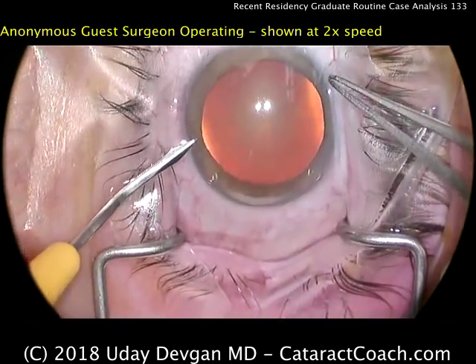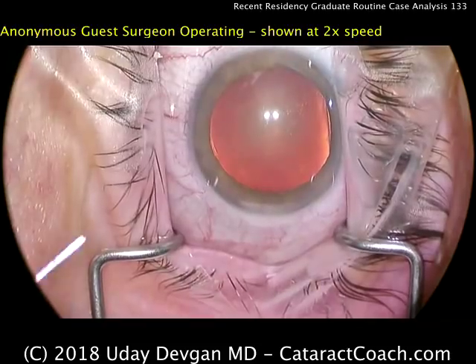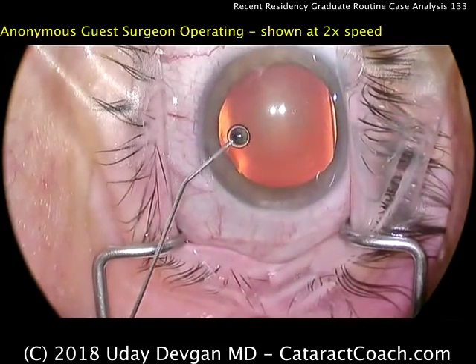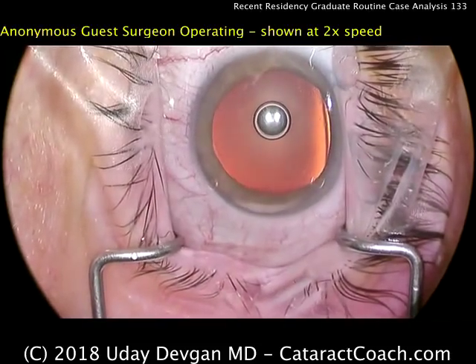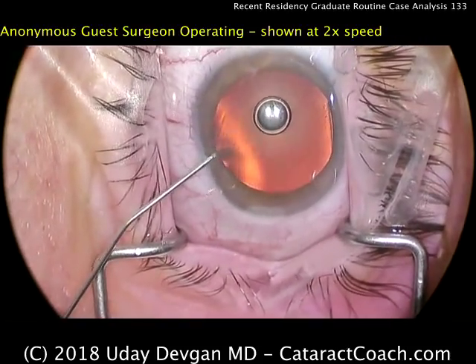CataractCoach.com. Today we're watching a routine case as performed by a recent graduate of an American residency program. This is not one of my residents — this was an anonymous submission to our website.